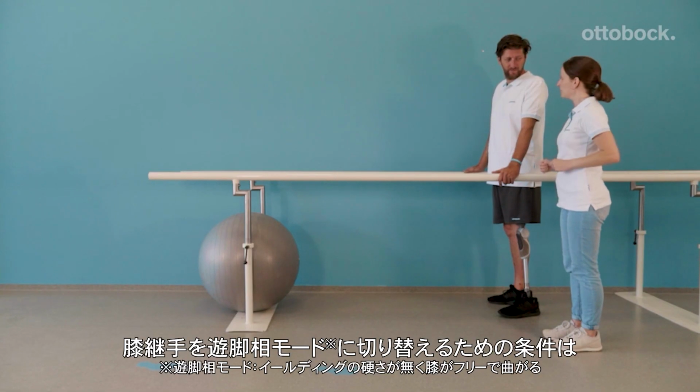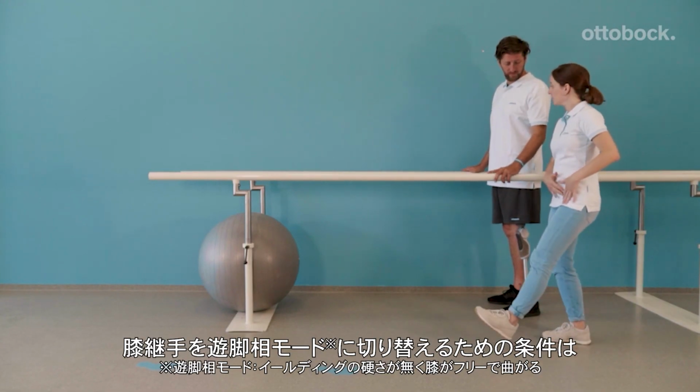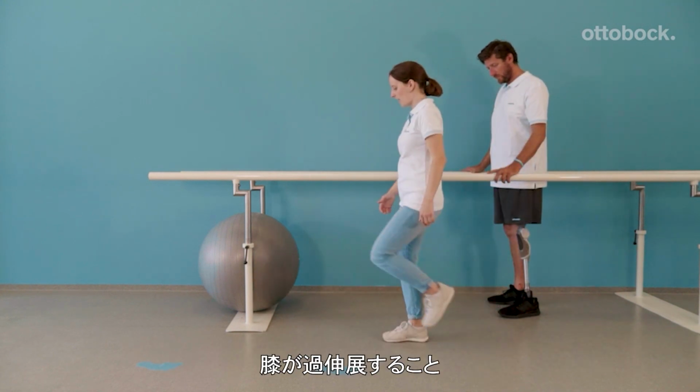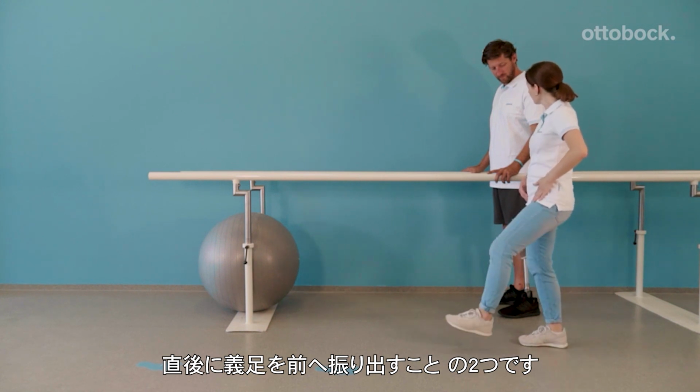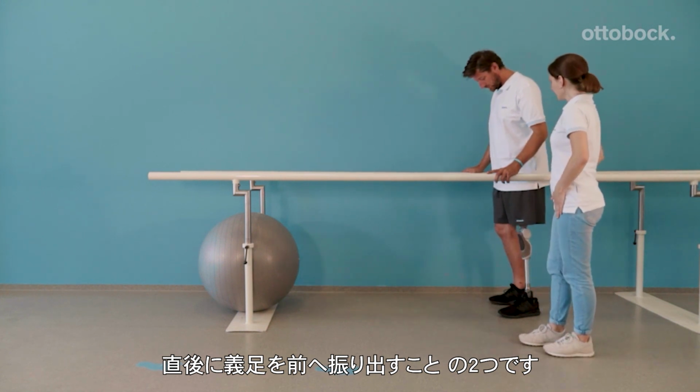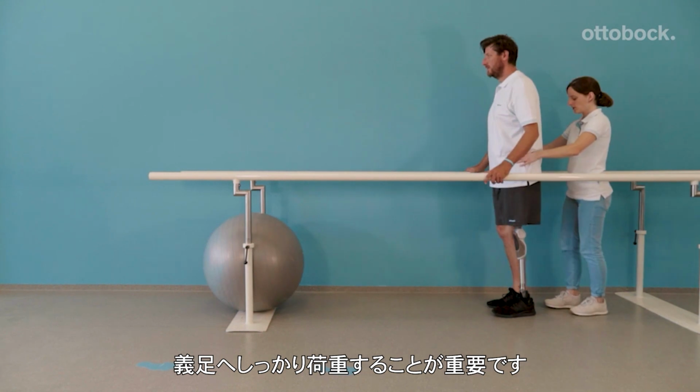For initiating stance release, these requirements are needed. First, a good foot rollover behavior, which leads to a knee joint extension moment, and second, hip flexion initiation without hesitation.